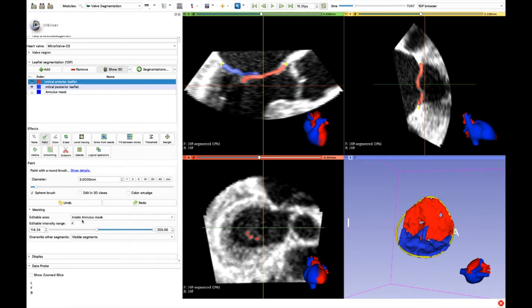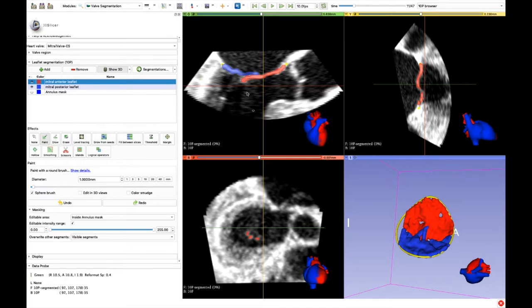Now that the biggest part of the segmentation is done, we can remove the lower threshold and use a smaller brush for the details, like small dropouts of the image or the coaptation surface that requires higher precision.